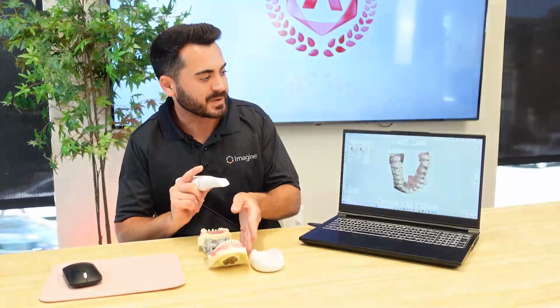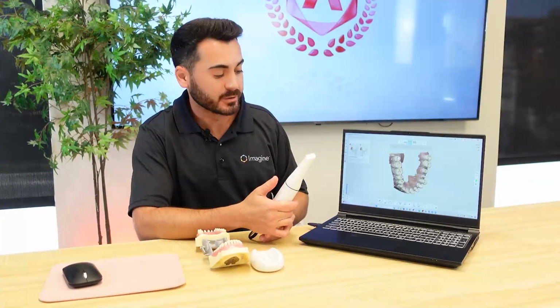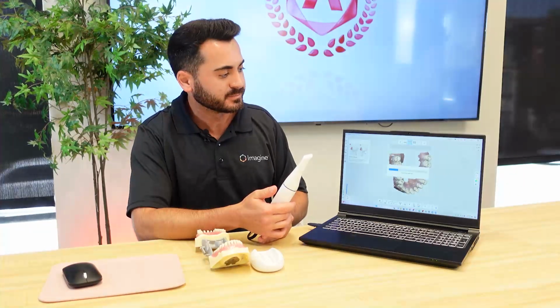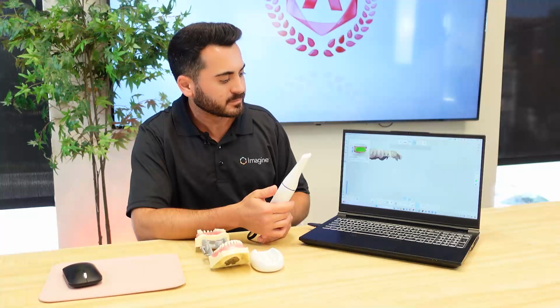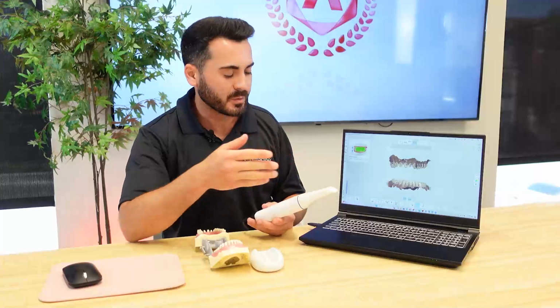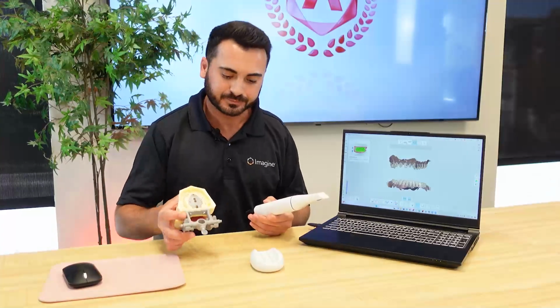Okay, once we captured our upper jaw, we can move on to our occlusion. I'm going to swipe right on my touchpad to move to my third stage. For our occlusion, you'll see the software will automatically bring in our upper and lower jaw.